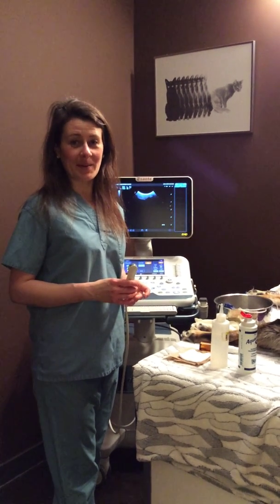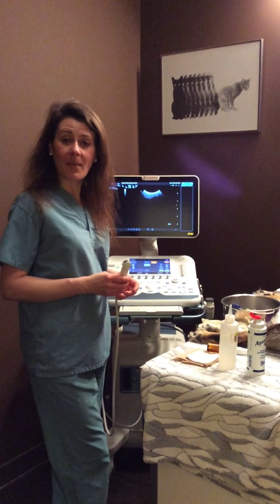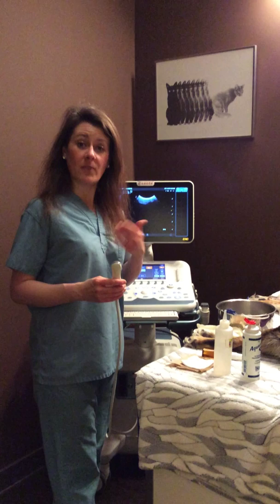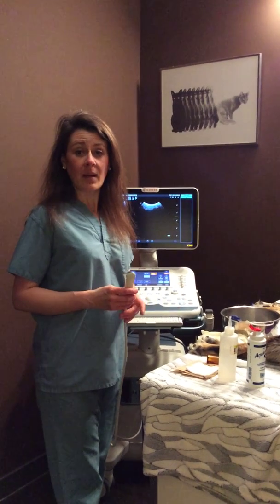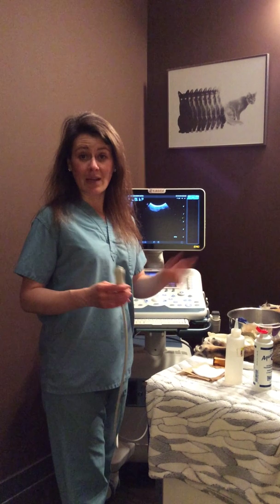Dr. Julie Schell from Beaumont Veterinary Hospital, and I'd like to introduce you to our new ultrasound machine. It's an Esoté MyLab 7, and I did a lot of research to figure out what type of unit could replace our old one, because we've had ultrasound at Beaumont Veterinary Hospital since about 2001.